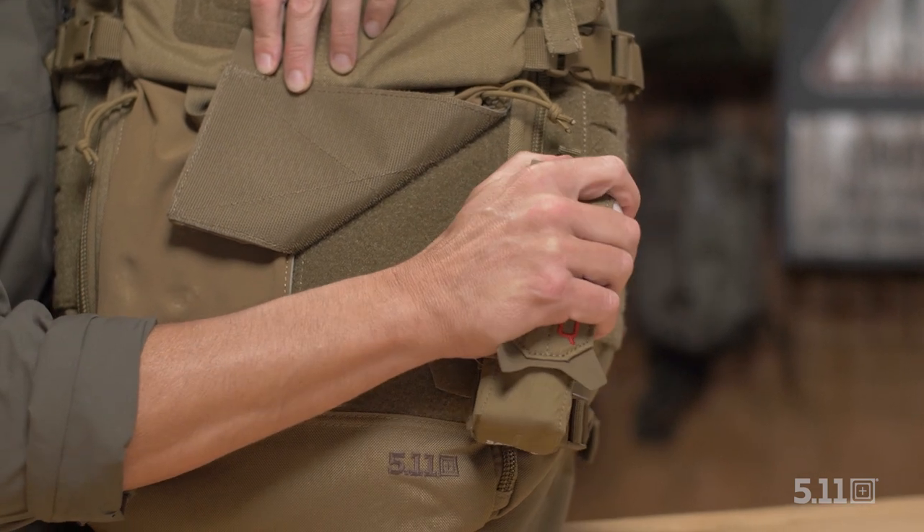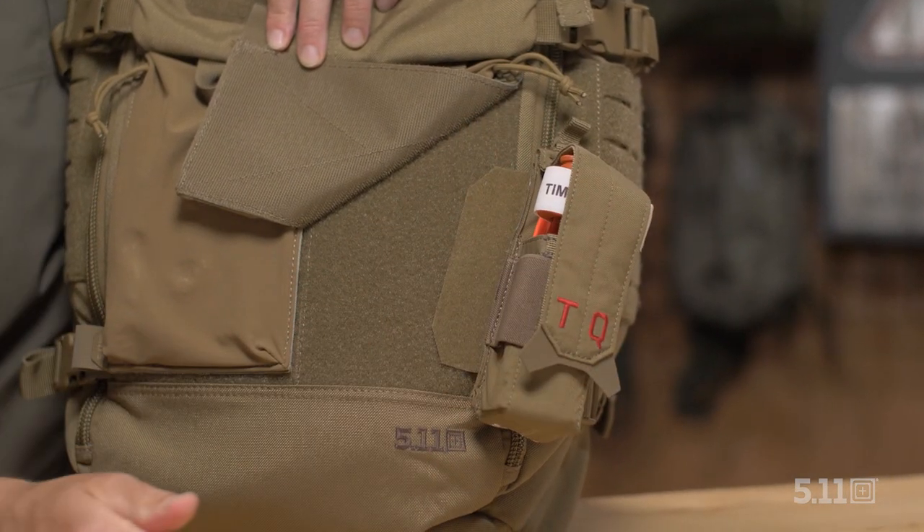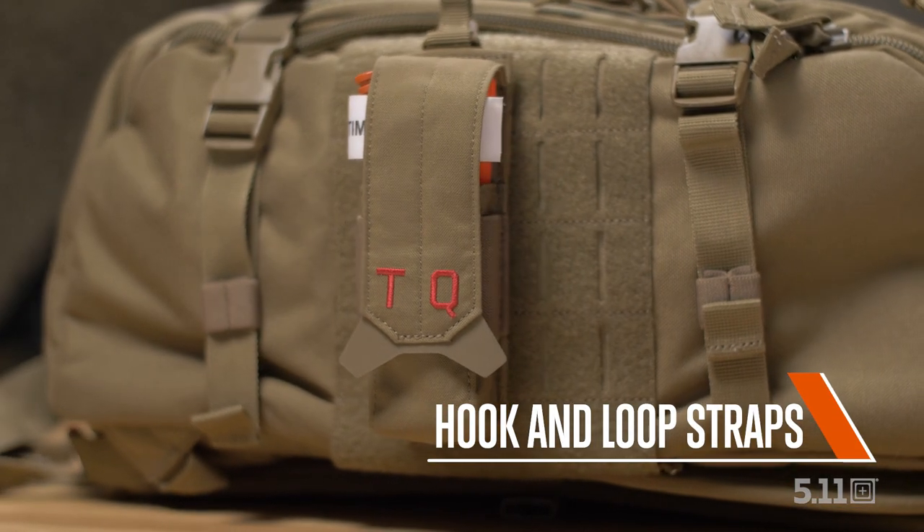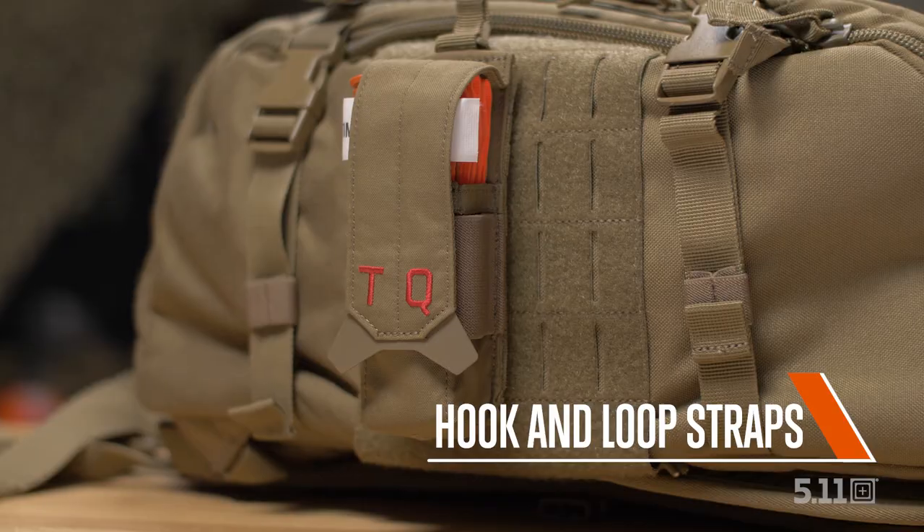Attach the Flex Tourniquet Pouch to your plate carrier or vest with the Flex HT mounting system, or use the hook and loop straps for a horizontal attachment to a plate carrier or belt.